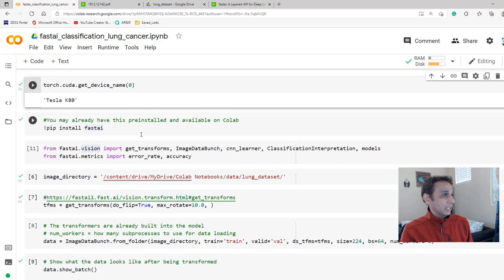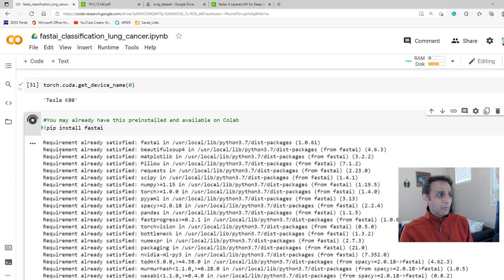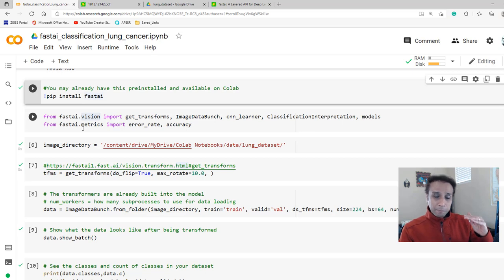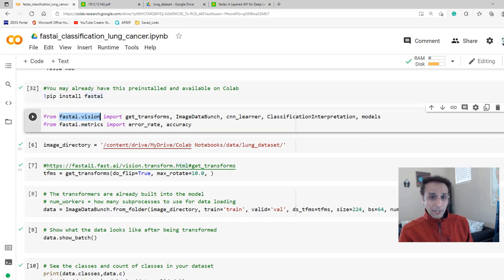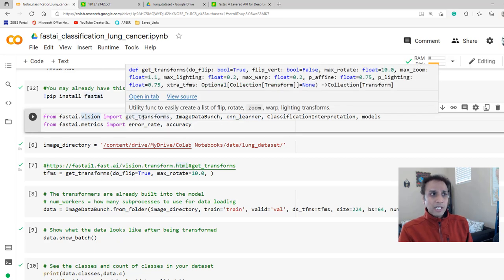Fast AI is already installed on Colab, so it probably says requirement already satisfied. Now from fastai.vision I'm importing specific methods: get_transforms for image augmentation, image_data_bunch to prepare data for the model, cnn_learner to create the model, classification_interpretation to study model predictions, and models which contains backbone architectures for transfer learning.